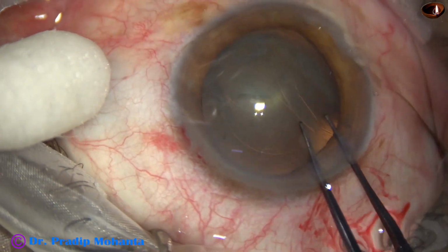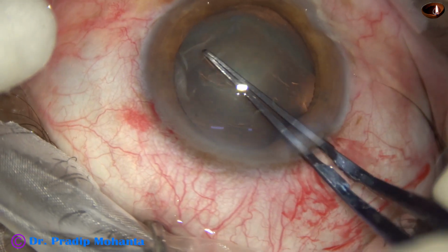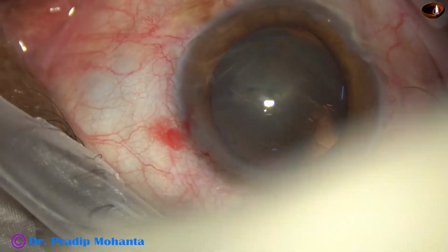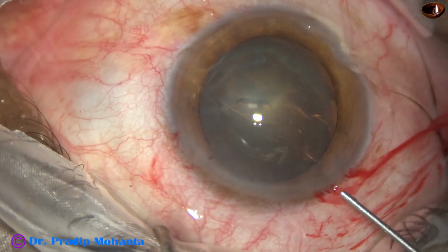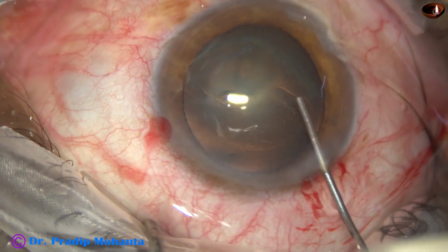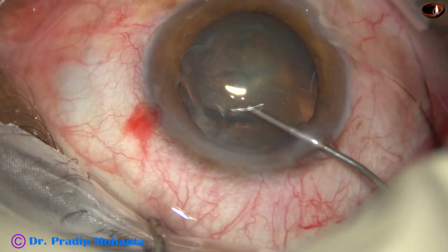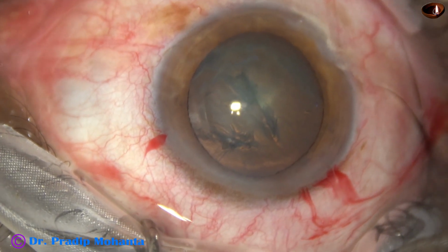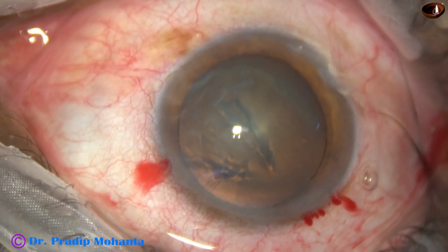After incisions and filling up the anterior chamber with visco, capsulorhexis is done with the help of utrata forceps. So the size of this rhexis is about 5 millimeter. When the size of the rhexis is about 5 millimeter, it is not easy to prolapse the nucleus into the anterior chamber or tilt the nucleus, and we have to do it in another way.